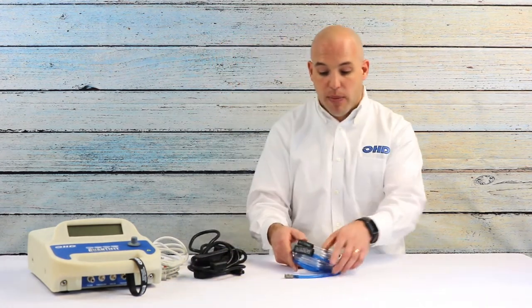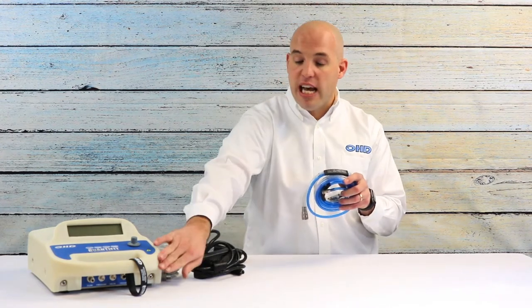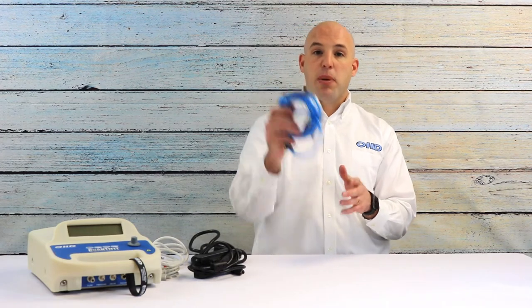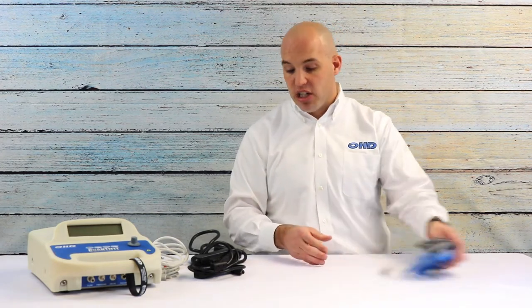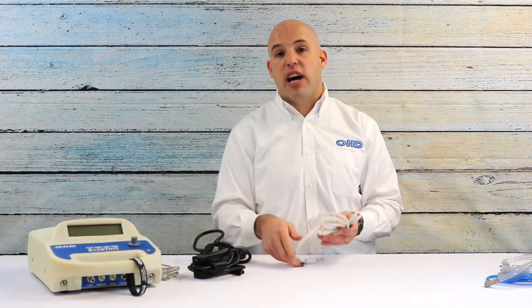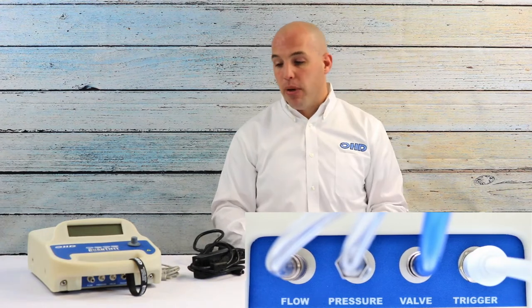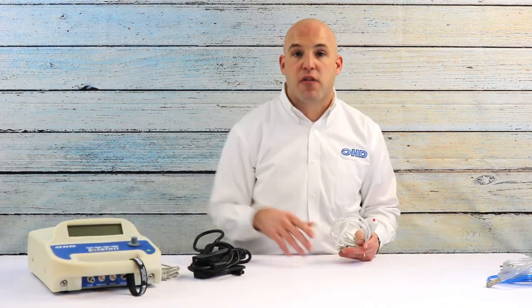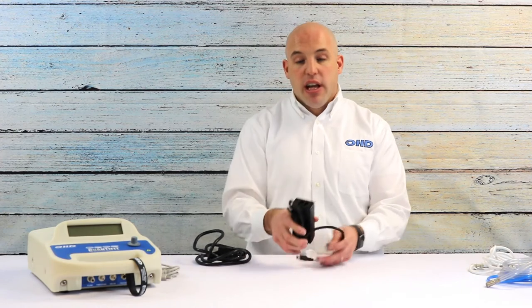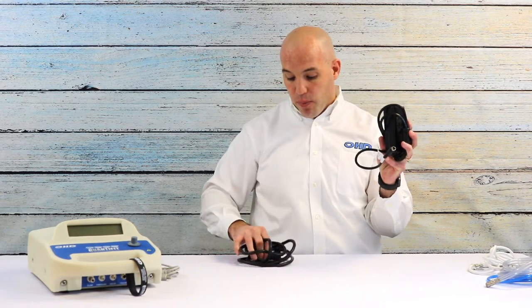The next thing that's pivotal is your triple tube assembly. These tubes are used to connect the device to the respirator and are also pivotal when we do our daily calibration. Next, we have our trigger button — the mechanism you'll use to actually activate the device when you want to challenge and test the respirator. The triple tubes and the trigger button both connect to the front of the instrument where they are clearly labeled.